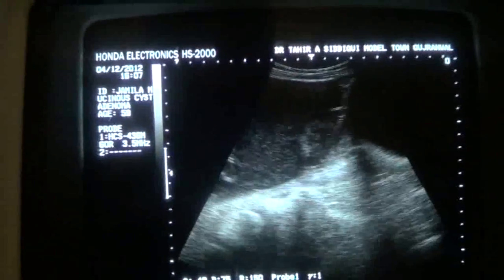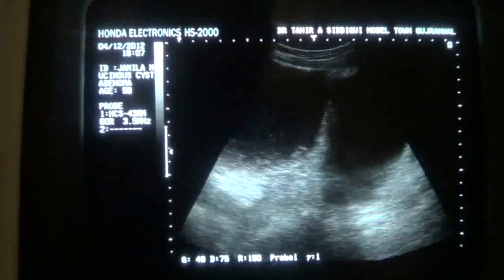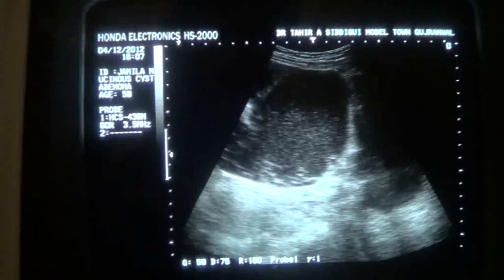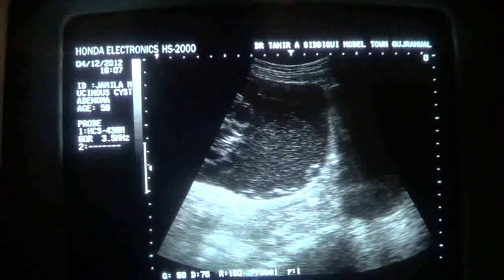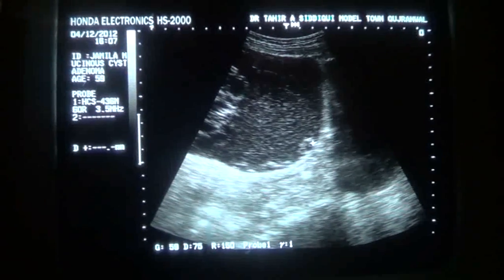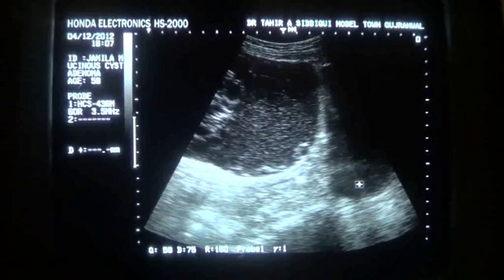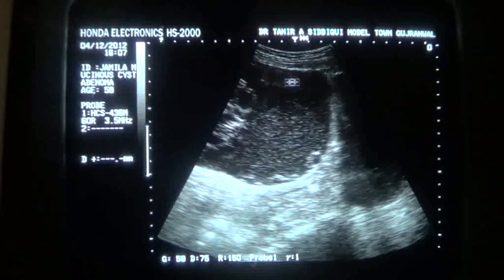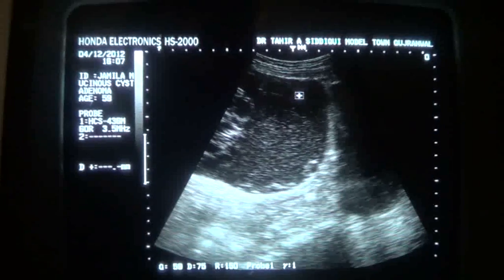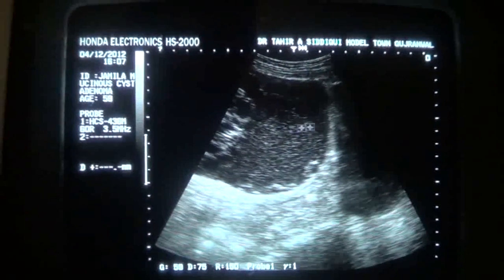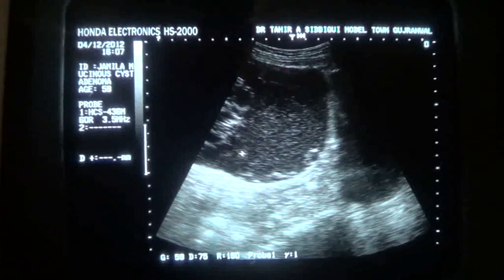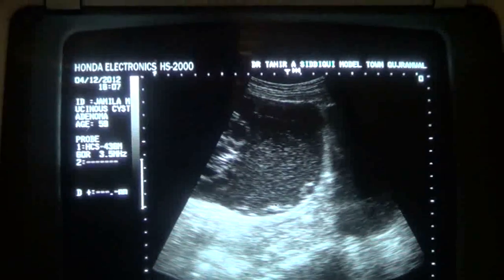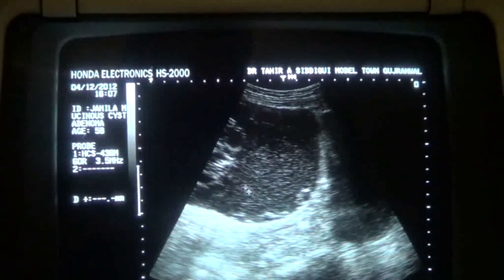Adjacent to the urinary bladder there is a cystic area which shows tiny calcifications. This is the urinary bladder in normal orientation. This is the cystic area — it is clear in its upper portion. This is fluid in the cyst, and this is the debris within this cystic area along with tiny calcifications and a few linear calcifications as well.